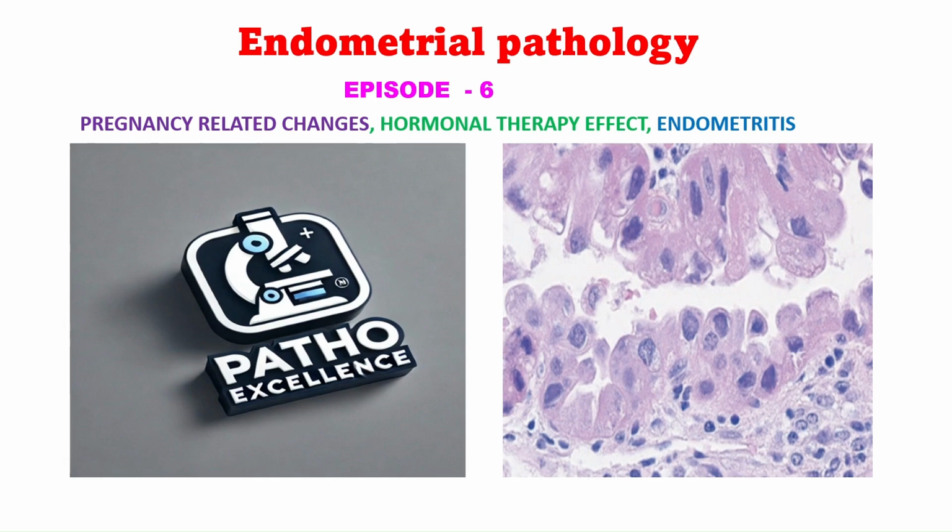In this endometrial pathology video series, in today's topic we will discuss pregnancy related changes, hormonal therapy effect and endometritis. Whenever we see an endometrial biopsy, we need clinical history to rule out any pregnancy related bleeding, or if the patient is on any hormonal therapy, or any cause of infection.